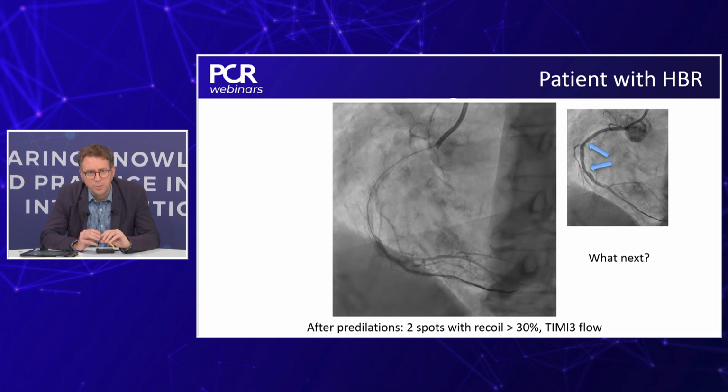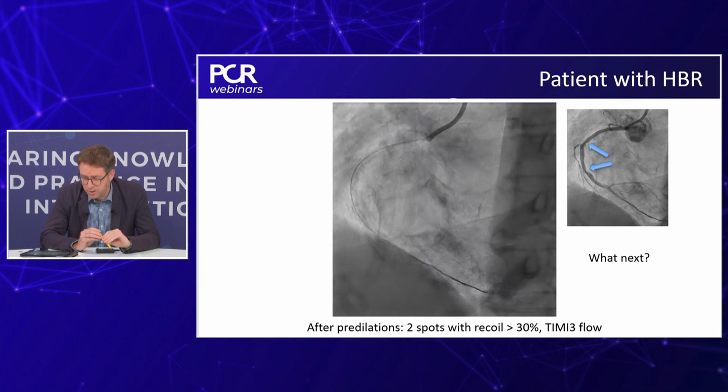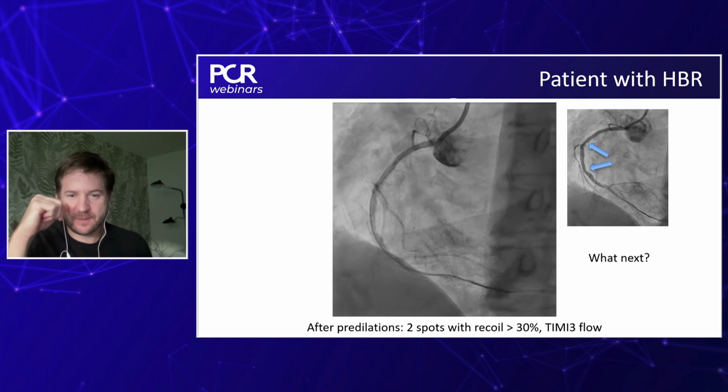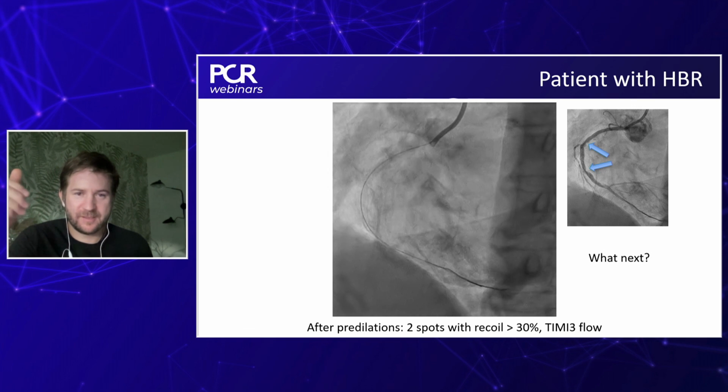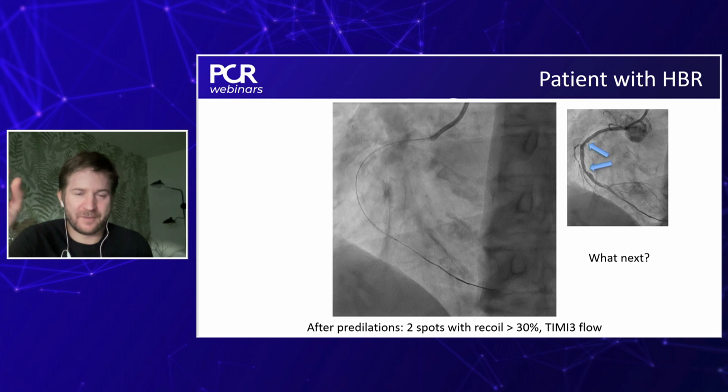So Gabor, how would you be dealing with this now? Is this acceptable? Do we now just go on and put the DCB in, or do you bail out to stent, or is there more work to be done? Well, considering the consensus document by Thomas and colleagues, it's still not good enough for DCB as it is, because you still have relevant recoils. So if you want to go for DCB alone, then you should further dilate these segments to see whether you can achieve a result with no recoil. Or if you think that this recoil always happens, then it might indicate putting in a stent. But then you have to consider why you wanted to go for a DCB alone strategy, and what spoke against putting in a stent at all. And I think in this case it's a very patient-tailored, individualized decision.